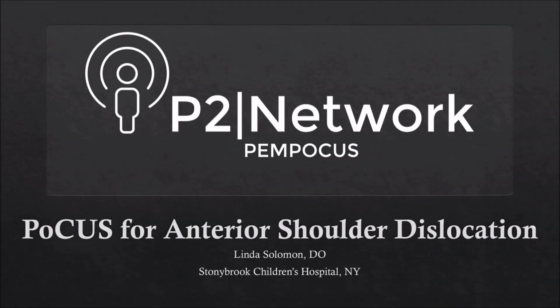Everyone, my name is Linda Solomon and I will be discussing the use of point-of-care ultrasound for the shoulder, specifically for the diagnosis and management of shoulder dislocation.